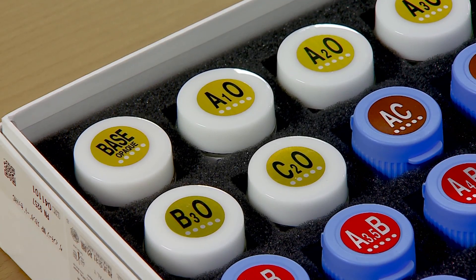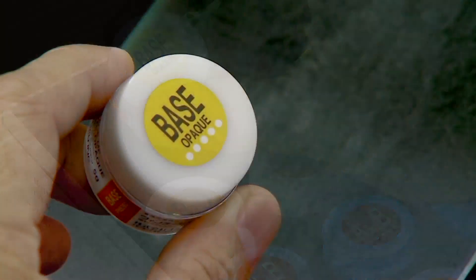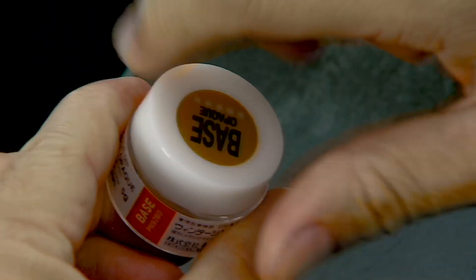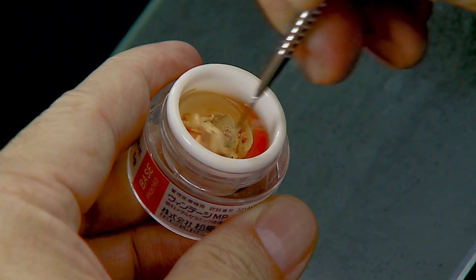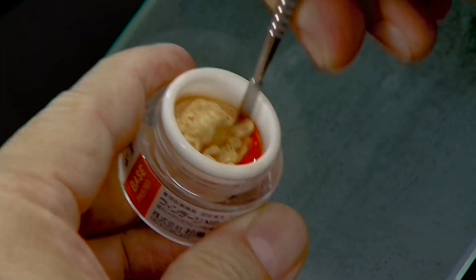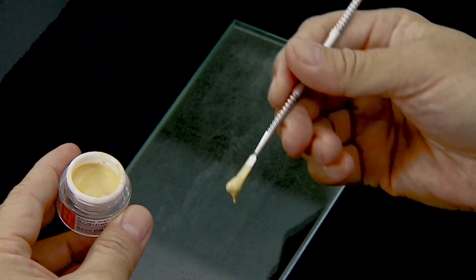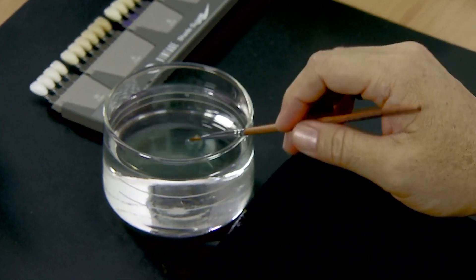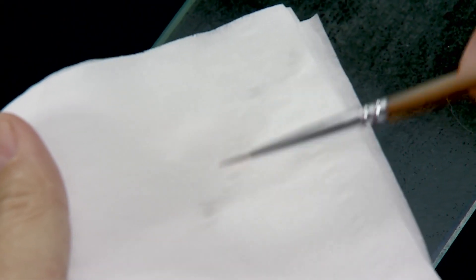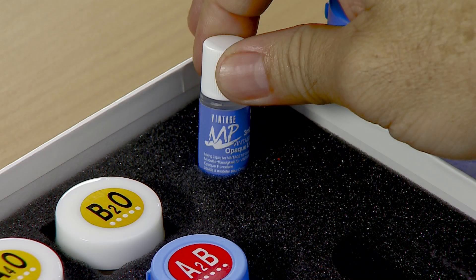Vintage MP base opaque is an ultra-fine foundation paste that creates a strong bond to the metal frame while imparting a warm hue for highly aesthetic restorations. Stir the base opaque paste gently and thoroughly and dispense the required portion onto the mixing glass slab. Clean and dry the porcelain brush to avoid excessive water, and sharpen the brush tip for better control. Vintage MP opaque liquid is added to adjust the viscosity of the base opaque as required.